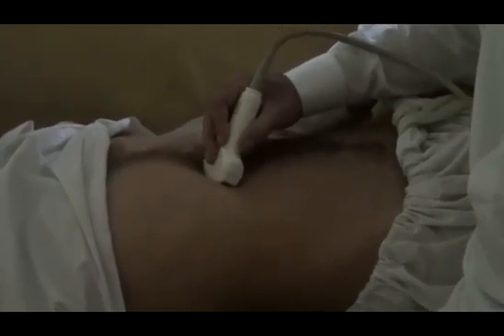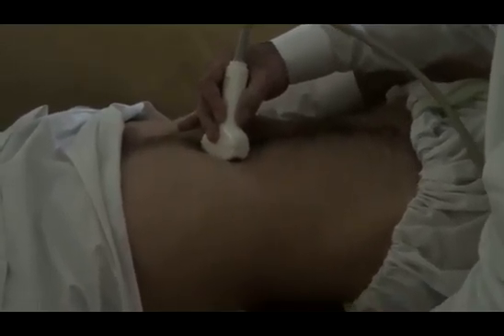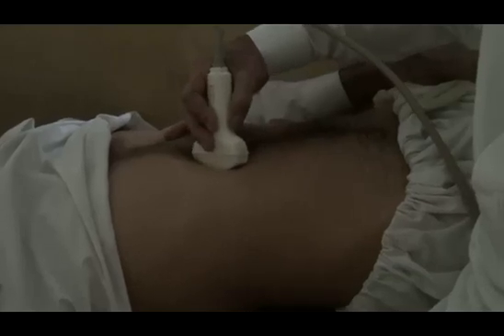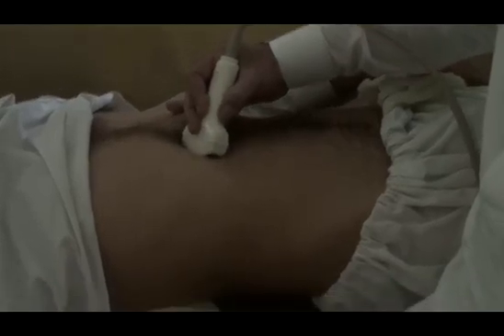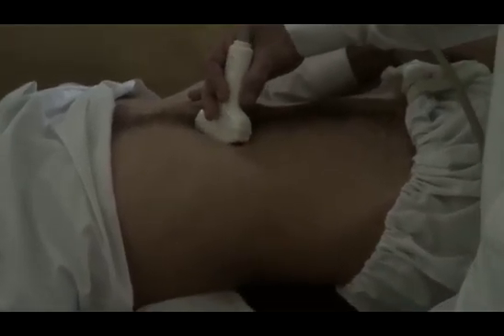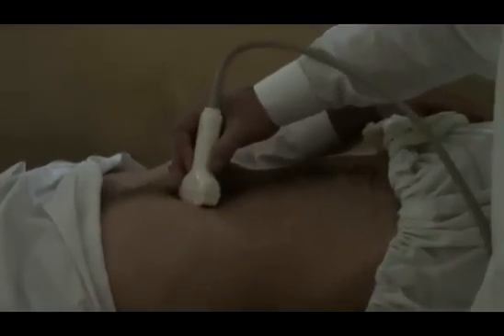You can get the gallbladder from this area. The difficulty in this scanning plan is that it is hard to see the fundus of the gallbladder. If you are having difficulty finding the gallbladder, place the probe obliquely in line with the subcostal region, acutely angulate, and you will get the gallbladder as we are seeing here.